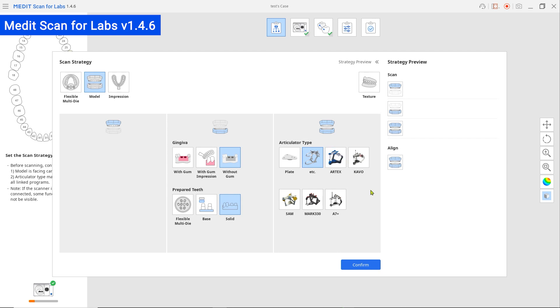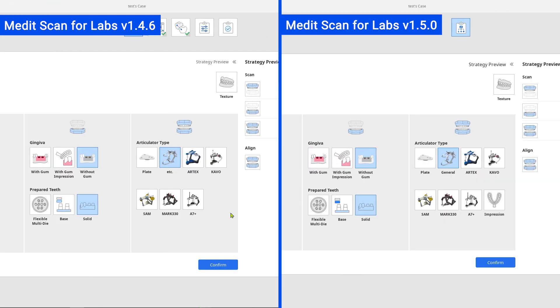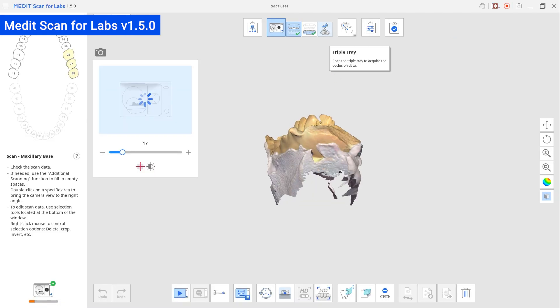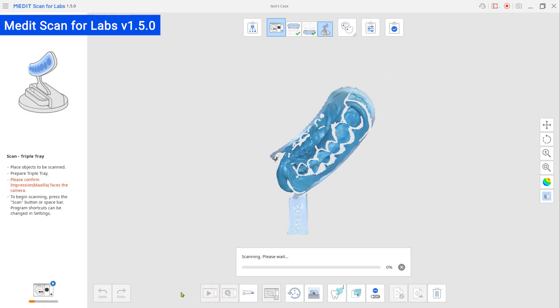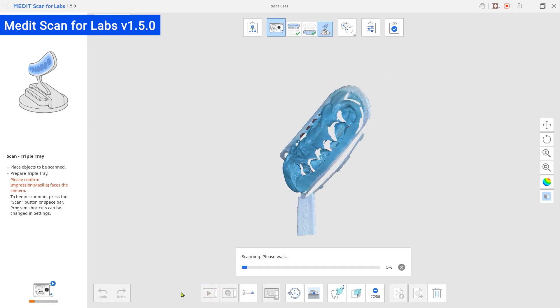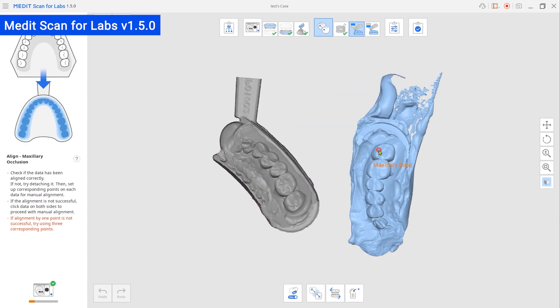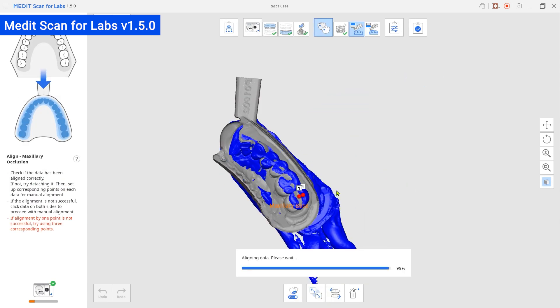We also made some improvements for scanning the occlusion. Now you can acquire occlusion data with an impression. And when adjusting the scan area before scanning, you can also adjust the height of the scanner's arm.